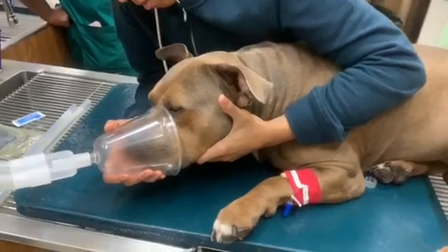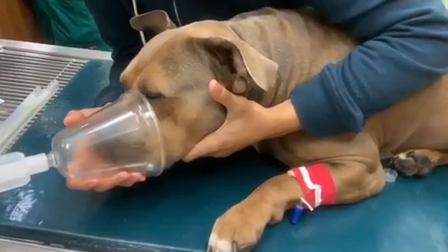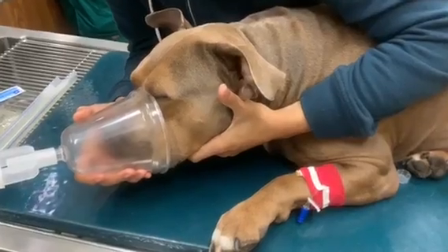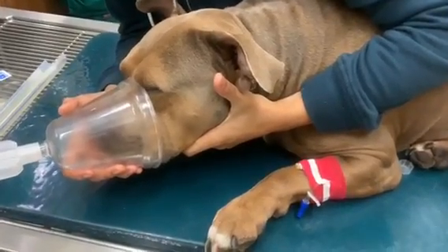Here is our patient being pre-medicated with oxygen prior to induction. He was pre-medicated with Torb for sedation to decrease anxiety, and we will be taking him into surgery shortly.